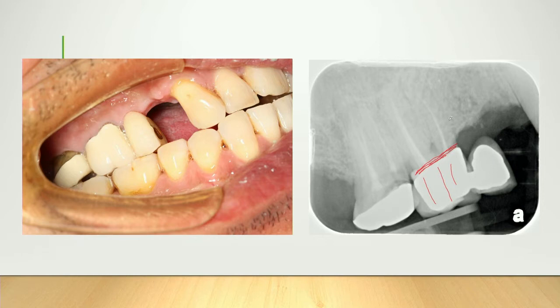Now we've got a question come in from Hasita Pelinda. What's the best way to go about extracting a tooth with bulbous roots? So I'll answer that one first, okay? So if, for example, let's pretend this case had bulbous roots, as well as root canal treated teeth. So if we go back to the slide so you can see. If that tooth had a bulbous root and it was root canal treated, that would really make your day. So let's just pretend like that, okay?